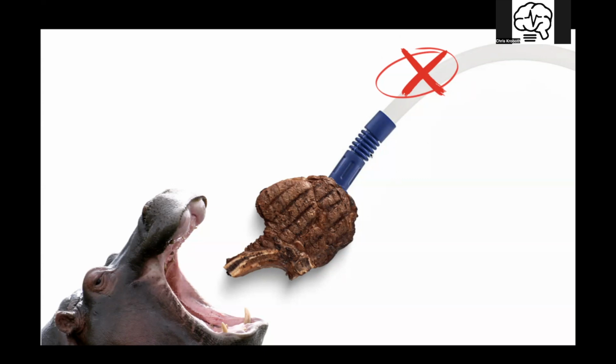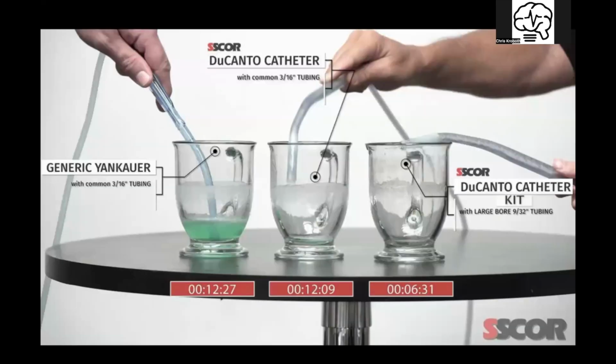What you can do to regulate when suction is on and off is to turn the suction on and off as you go in. What I did was have the suction off, placed this on the big piece of steak that was lodged in the patient's mouth, turned it on, it pulled the big T-bone out, and I just walked the catheter back out. This has a large lumen end. You just lose that regulatory ability by not having that open port to prevent suction.